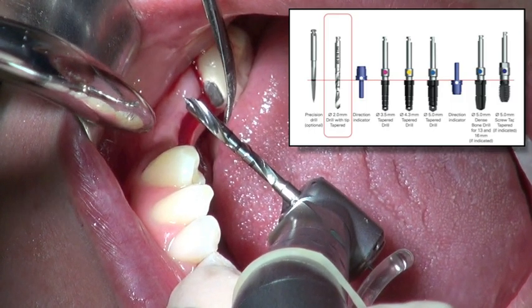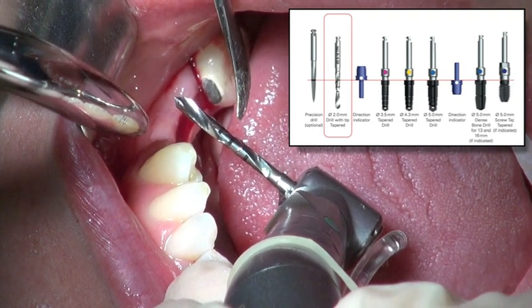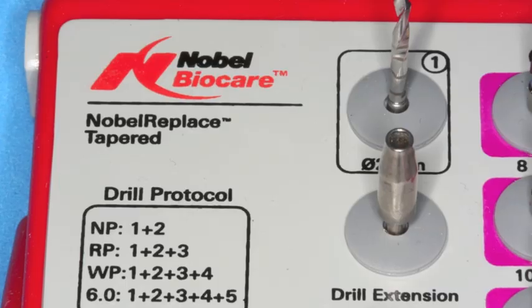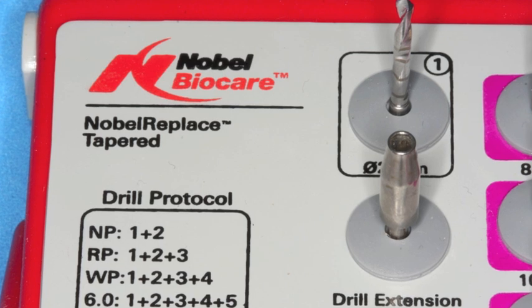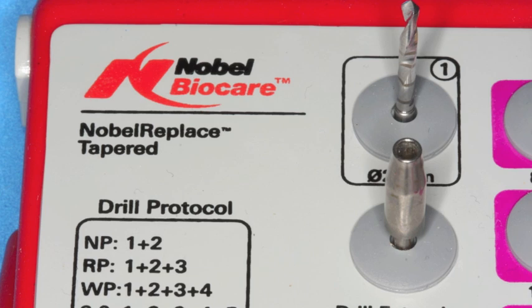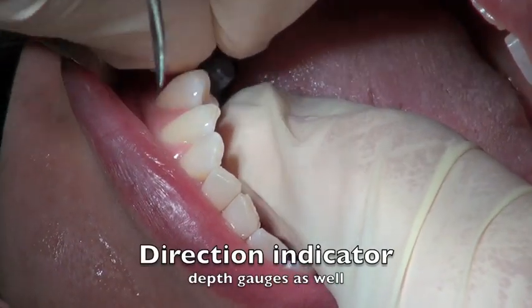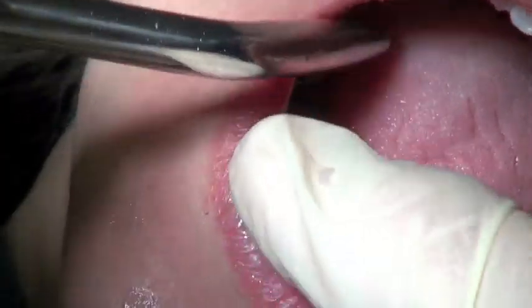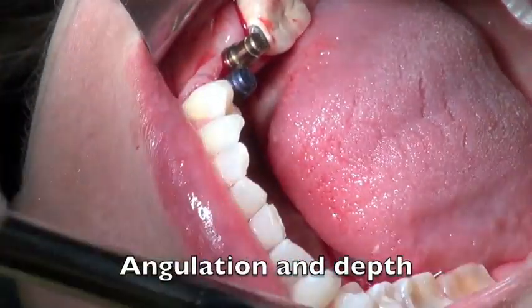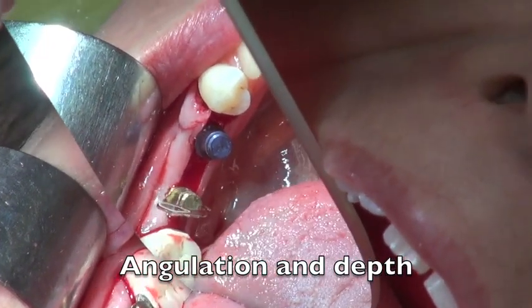I'll use a two millimeter twist drill to go in about eight millimeters so I can do some calibration of the ridge, as it's been healing since the CT scan. We're going to go through the RP protocol: drill one, two, and three. The first drill is the two millimeter twist drill taken down to about eight millimeters. I'll place some direction indicators so I can take an x-ray — measure twice, cut once. I'm happy with the angulation of these two indicators and we're going to confirm the depth.